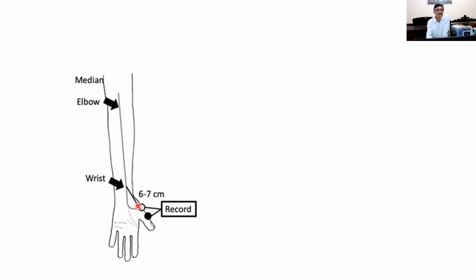The action potential in the muscle generates a signal that is captured here a few milliseconds after the original stimulus, because it has to travel and go through the neuromuscular junction and stimulate the muscle. That gap is known as the latency period.